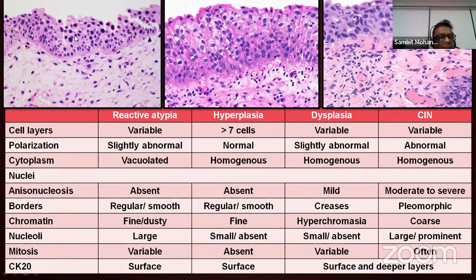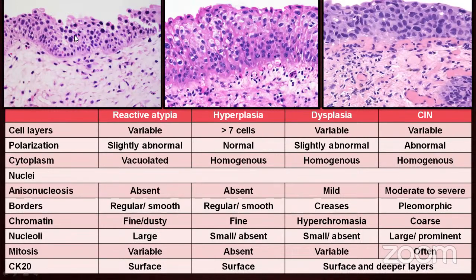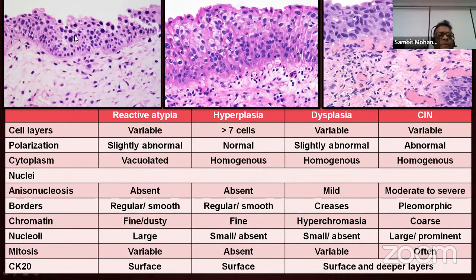And in the comment, you write down all the morphologic features and ask for immunostain. But immunostain is basically not available in a lot of places. So how is the immunostain going to help you? Who is going to tell me what is the Uro-3 cocktail? How is immunostain going to help in this scenario, if at all it is available in your lab?